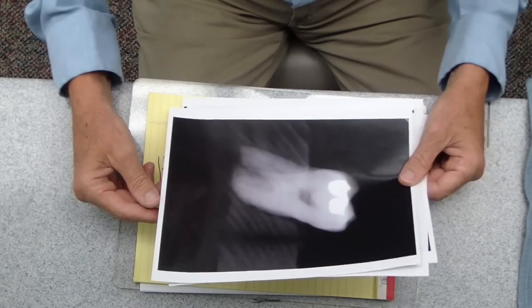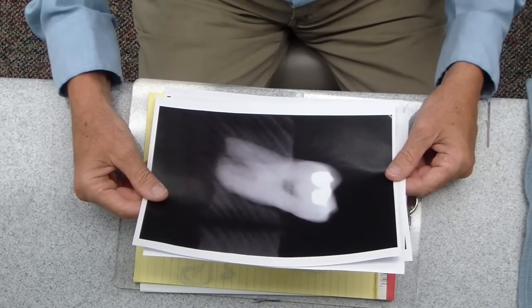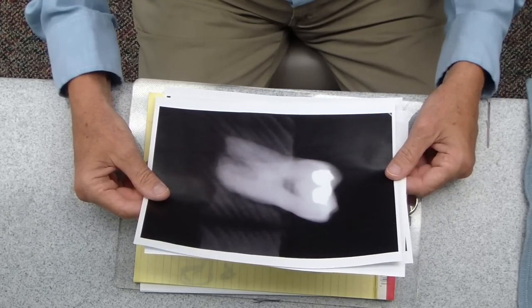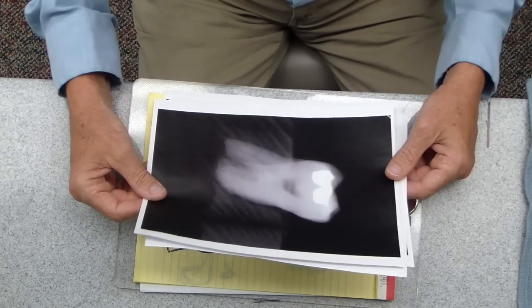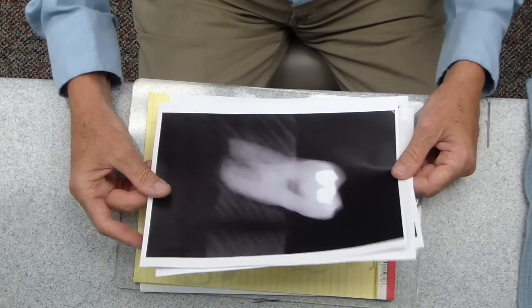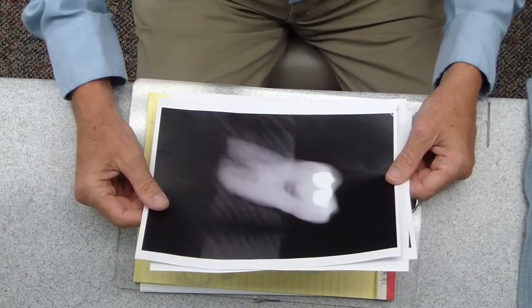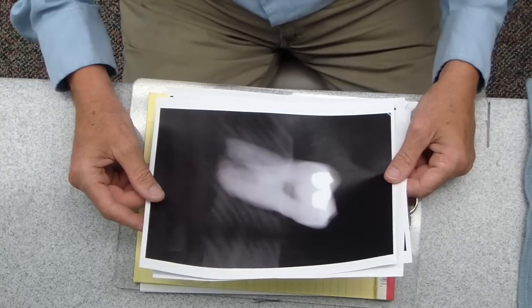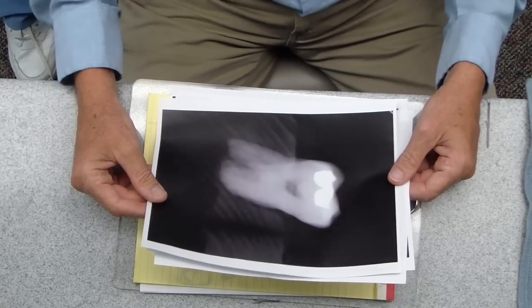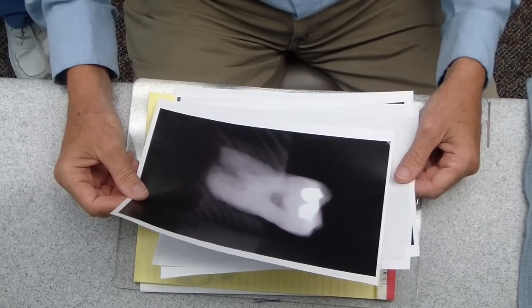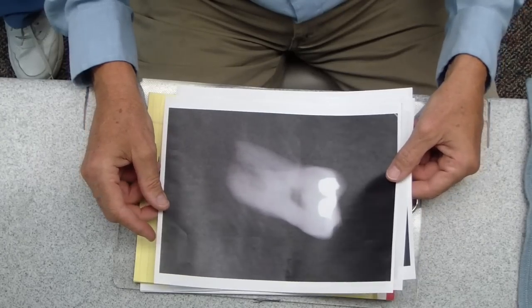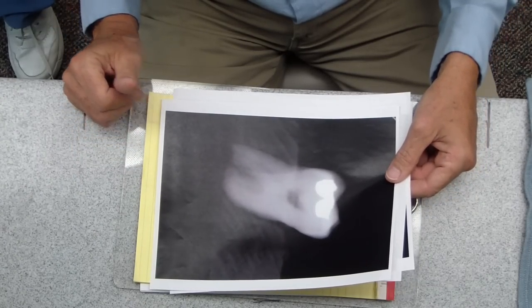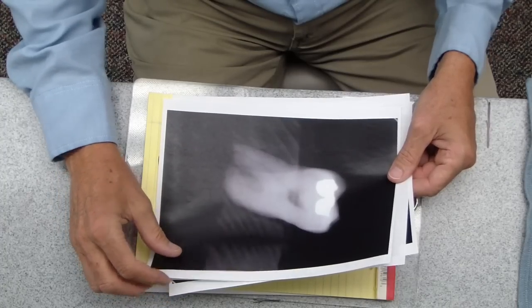Now, if you just take out one root at a time, you only have to apply theoretically one-third of the force you would if you took out the whole tooth at a time. And if you do have an opening, you've only got an opening through one root rather than all three roots. So for a number of reasons on these isolated teeth with a large pneumatization of the sinus, it's probably best to go ahead and section them. Here's a radiograph of the tooth that we're looking at today.